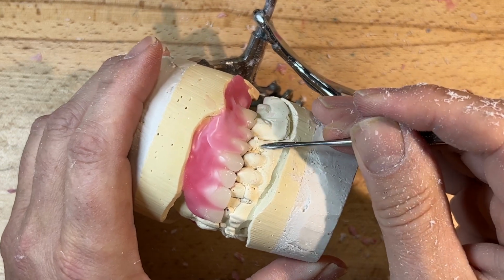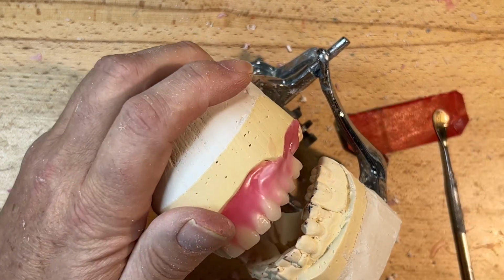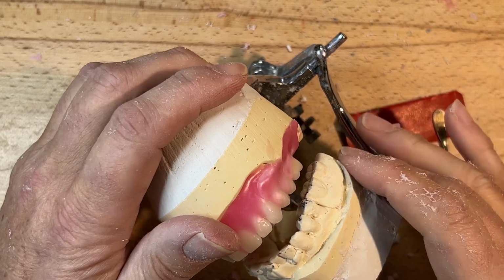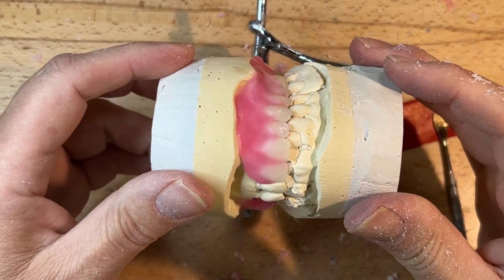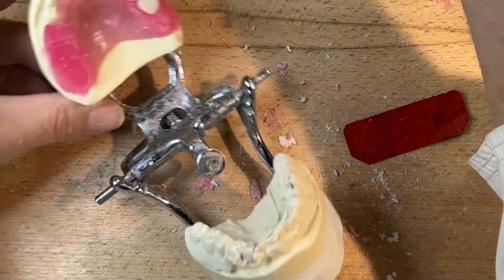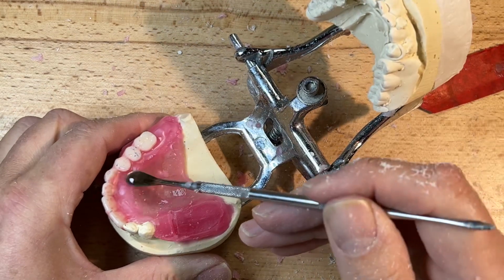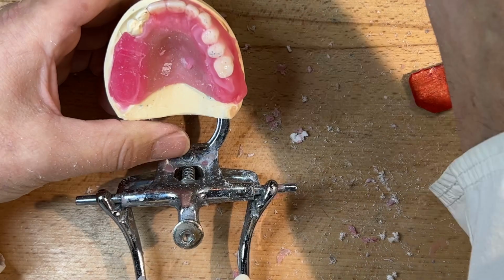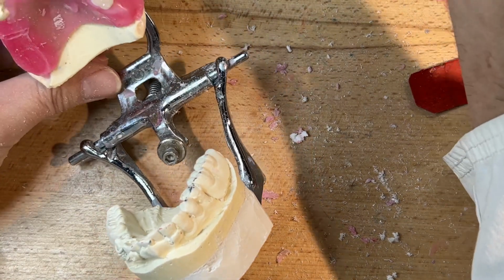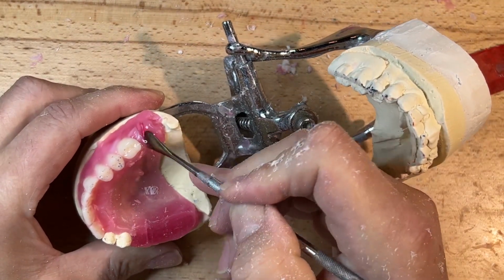You can see a slight step between 5 and 6. And then maybe if I reduce the buccal cusp tip of 5, then it won't be as drastic. So I can kind of angle that up. I do have overjet on the 5. And then that would make it a little bit smoother transition between 5 and 6. So we don't have this kind of stepping. And then I reduce the occlusion of number 6 to lower the buccal cusp tips of 6, to kind of give it the illusion that it is the same as 5. Is it perfectly the same? No, but it's a lot closer than if I didn't adjust the buccal cusp tip of 5 and or the occlusion of number 6. We'll go to number 7 here.